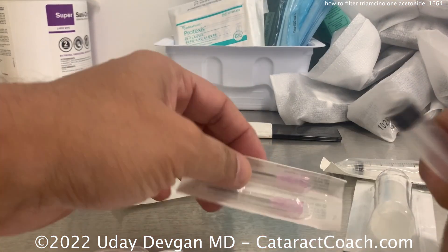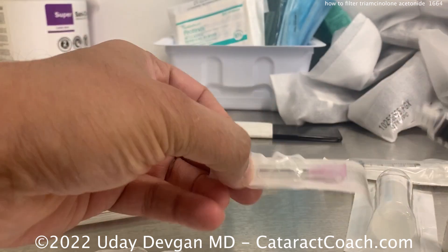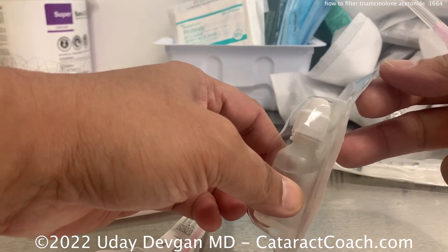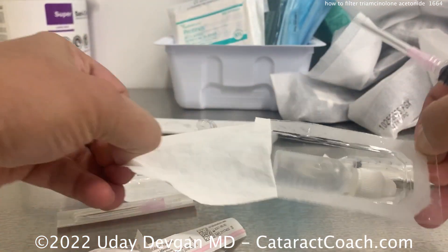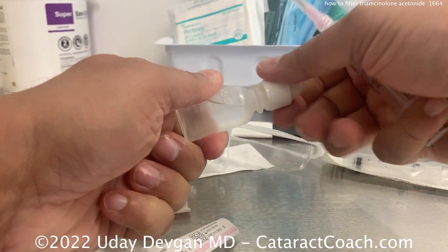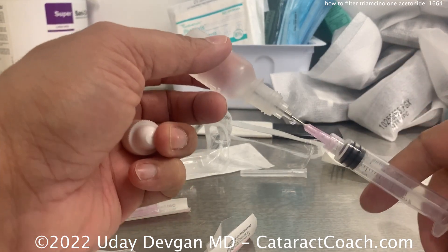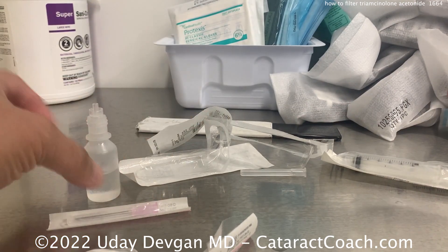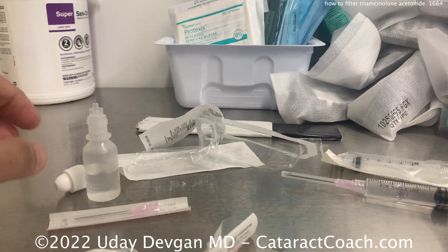So we'll get our syringe here — everything is nice and sterile. Break off the needle here. We're keeping the parts of the instruments — the needle that touches anything important — sterile. Obviously the outside doesn't need to be sterile. Here's our bottle of BSS, so we'll peel that open too. This is a sterile irrigating bottle, balanced salt solution, and we're just going to draw some of this up in the syringe. The vial of Kenalog has one milliliter in it. So if you want to do it one-to-one and keep the same strength, draw one cc of BSS. Or if you want to dilute it down, draw a little bit more. We can decide later how much to use. Let's carefully put that needle back on. Now I've got sterile BSS in one syringe.